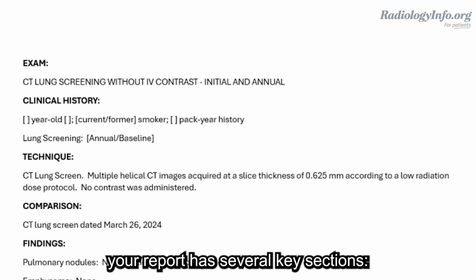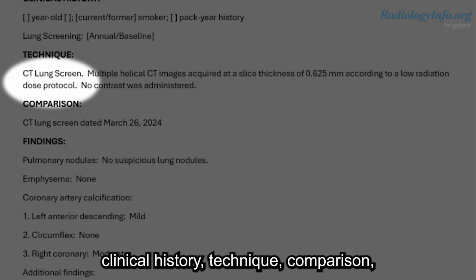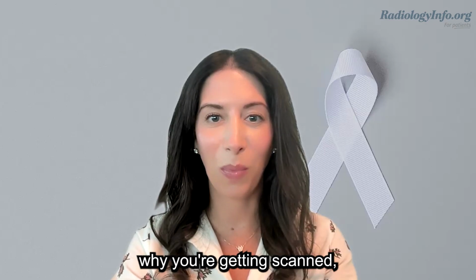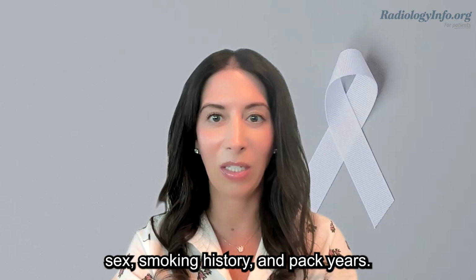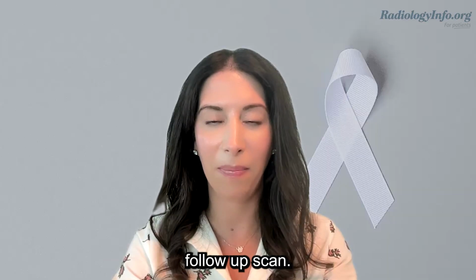Your report has several key sections: clinical history, technique, comparison, findings, and impression. Clinical history. This section explains why you're getting scanned, or in this case, screened. For lung cancer screening, it usually includes your age, sex, smoking history and pack years, and whether it's your first baseline scan or an annual or follow-up scan.